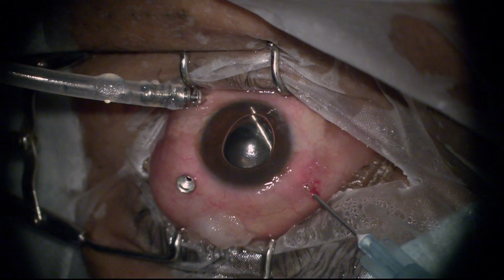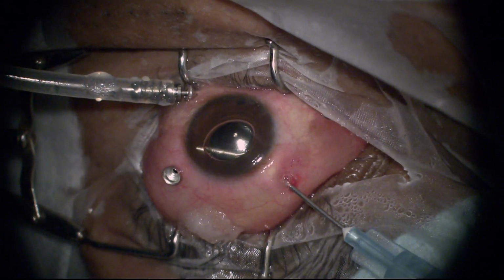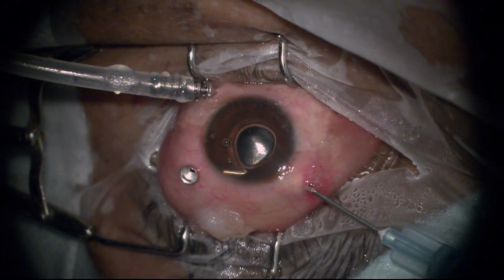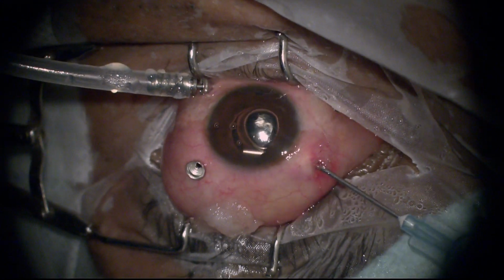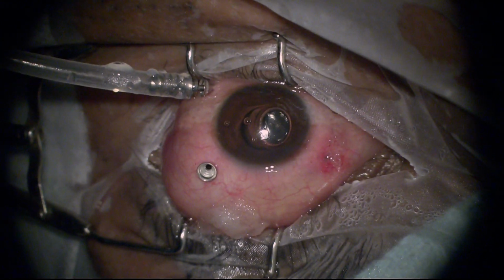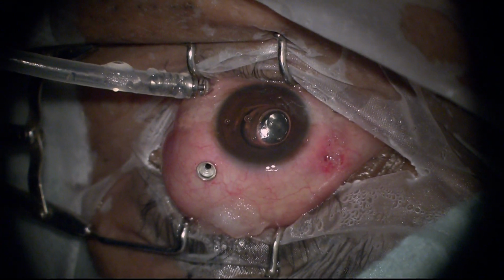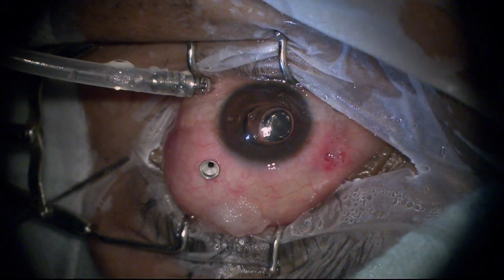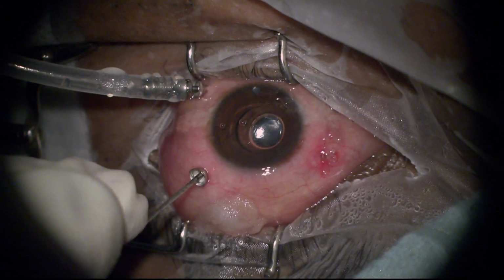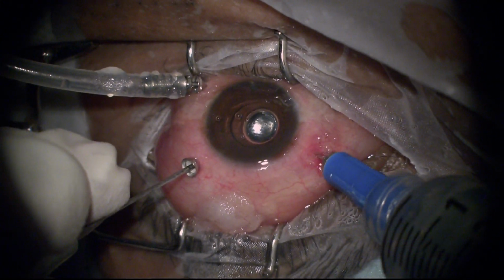So you inject some viscoelastic in between the iris and the cornea so that this space is formed, and then the viscoelastic can be easily drained out by the aqueous drainage system. So this will be flushed out later on. So right now we have air in the vitreous cavity, and we have some viscoelastic gel in the anterior chamber along with the inferior iridectomy.